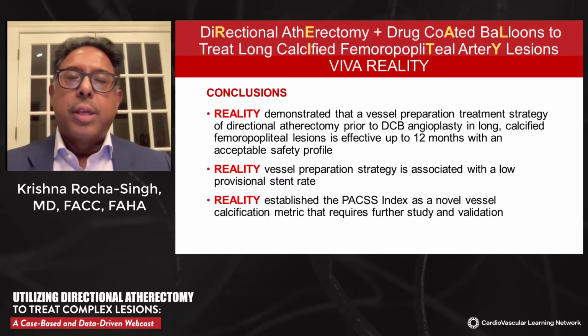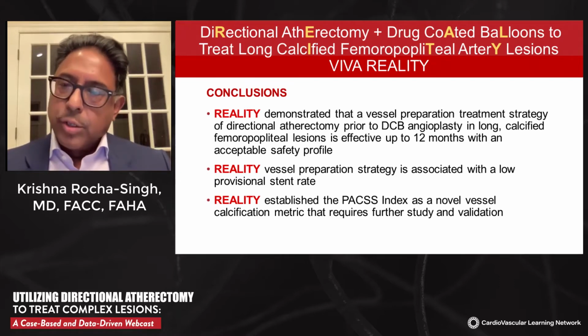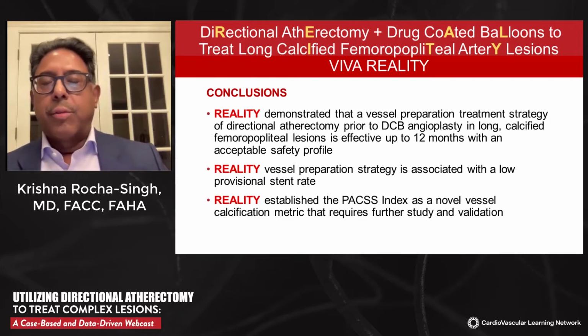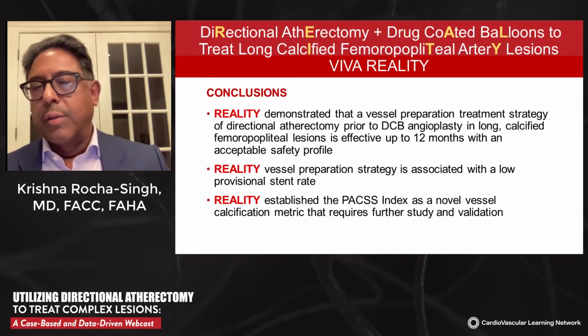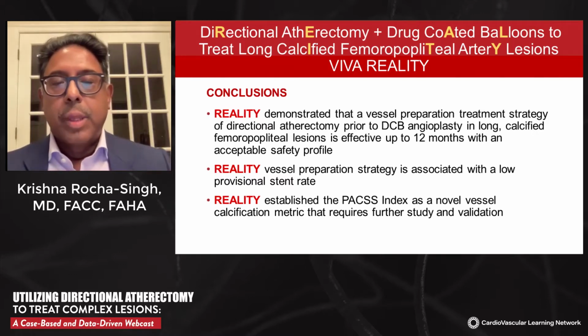So in conclusion, I think REALITY demonstrates that a vessel preparation strategy that uses directional atherectomy prior to the application of DCB angioplasty in long calcified lesions is both safe and effective through 12-month follow-up.